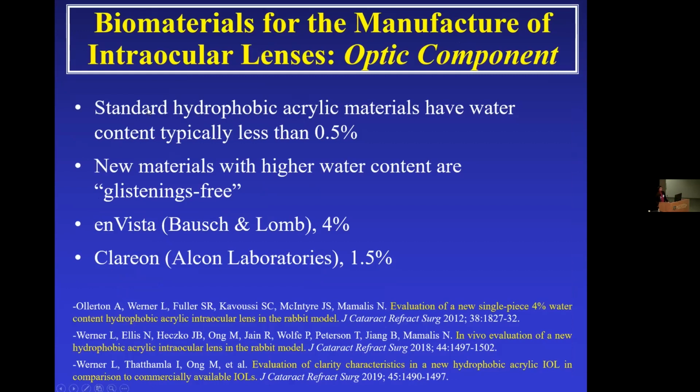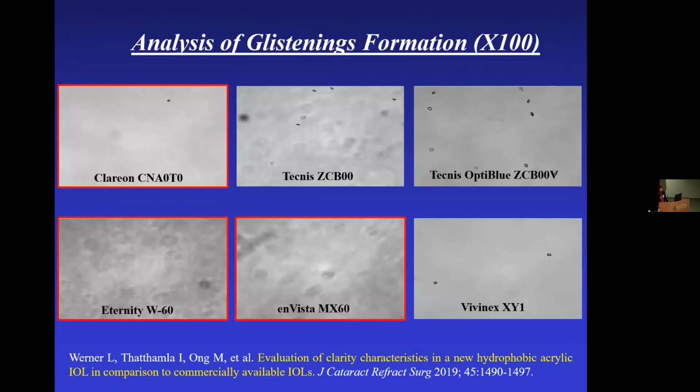And again, I mentioned that now we have the glistenings-free hydrophobic acrylic materials, and I had the opportunity to evaluate all of these lenses in the lab. You put them in solution, you change the temperature, and indeed these lenses here fit the description of glistenings-free lenses.